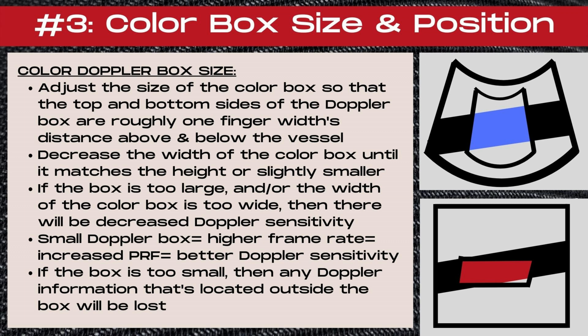The next step in our color Doppler optimization checklist is to adjust the color box size and position. Adjust the size of the color box so that the top and bottom sides are roughly one finger width distance above and below the vessel or area of interest. Then decrease the width of the color box until it matches the height or is slightly smaller than the height. If the color Doppler box is too large and or the width is too wide, there will be decreased Doppler sensitivity.